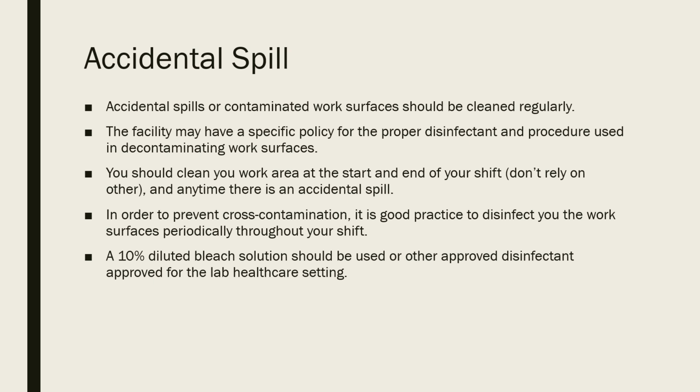When you're doing PCR testing, the patient that you work with is positive and you contaminate your work surface, and then your next patient behind that patient is negative, but you accidentally drop your swab on the counter while you're preparing your test, and you've contaminated your patient that's negative with a patient that's positive. So these are all things you got to keep in mind when you're working, is not to cross-contaminate, making sure that you're always keeping a clean, organized workspace.